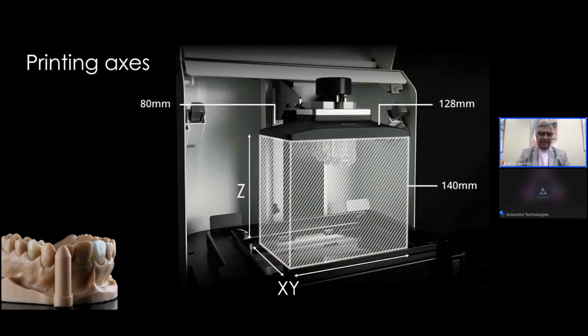Before we do that, however, let's get a fundamental understanding of the multiple axes that exist in printing. If you talk to people who are very familiar with 3D printing, you'll hear them talk about XY resolution and Z-axis resolution, Z-axis calibration. So let's put some of these terms into place. The XY is basically the platform's width and the platform's length, and I hope you can see that on my screen right at the bottom. So the X and the Y basically define the size of the platform.